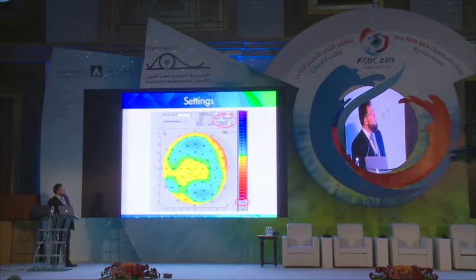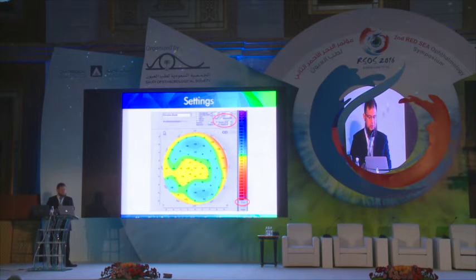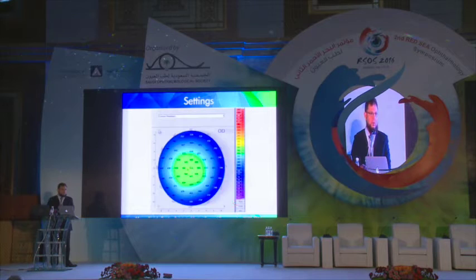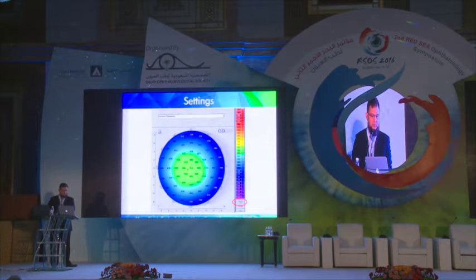For the elevation map, I have to adjust the diameter of the reference body to be 8mm because it is a standard. And I use 5 micrometer increments between colors because it is better to give details and better not to exaggerate the small details. For the pachymetry map, I use the 10 micrometer increments.